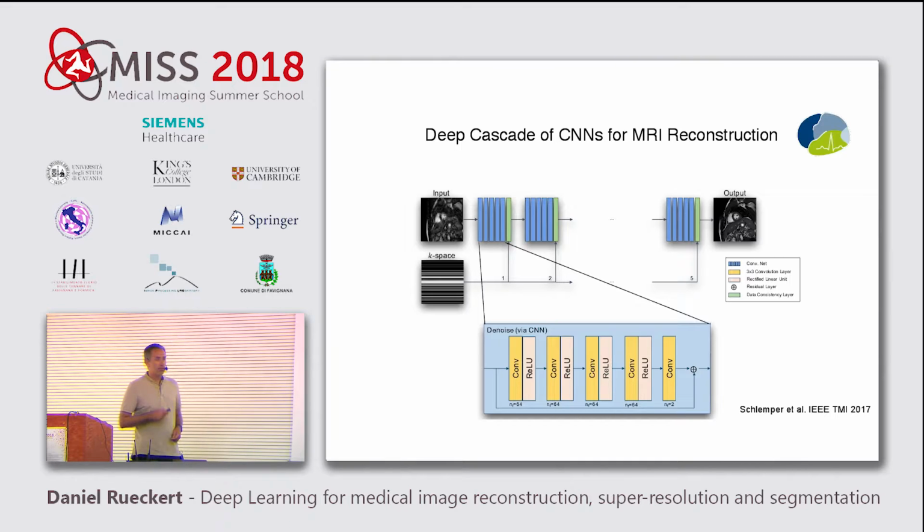So the neural network which we now have has two sets of layers in it. The first set of layers are these blue layers, which are nothing else than denoising the image. Okay? They're effectively convolutions, learned convolutional filters, which are simply acting as denoising terms on the image.